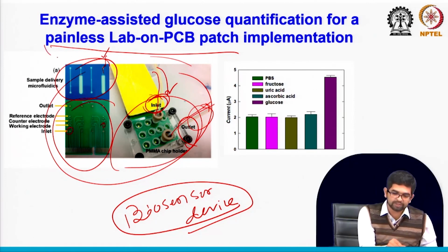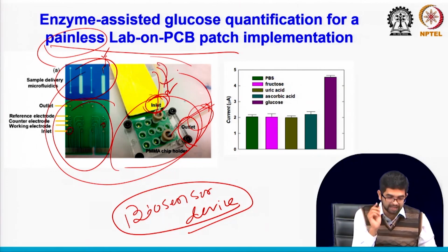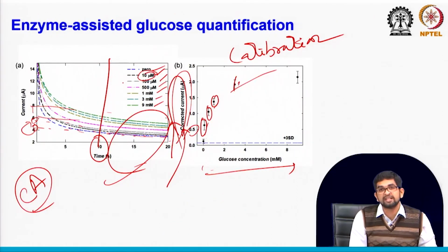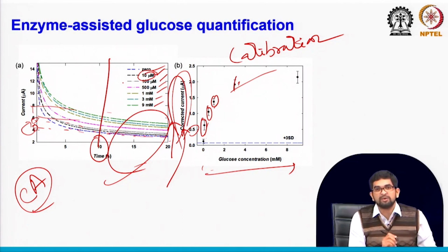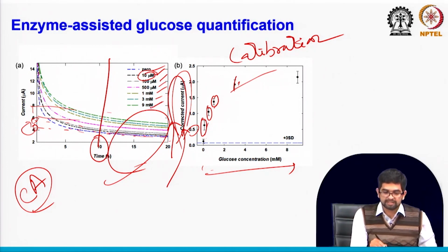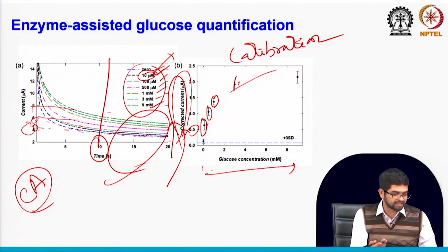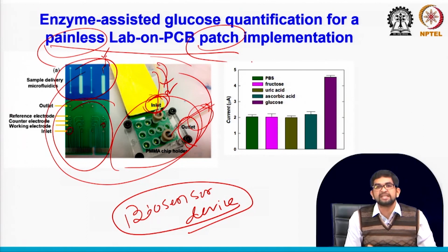A painless patch, why did I say that? Because here I wanted to use a sweat sample. And one important thing you have observed here: we can detect 10 micromolar glucose from this setup. Our sweat glucose level is really very low, but your serum or blood glucose is very high, in the millimolar range, while your sweat glucose level is in the micromolar range, and your sensor can detect in the micromolar range. So this sensor can be useful for painless lab-on-a-PCB patch implementations.